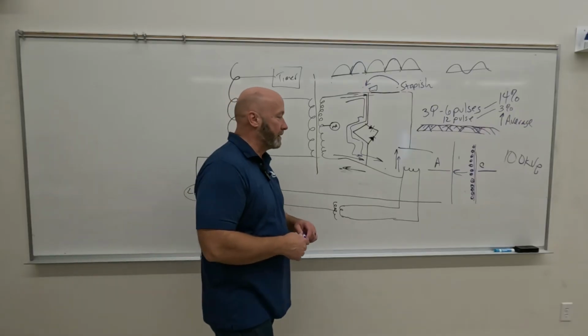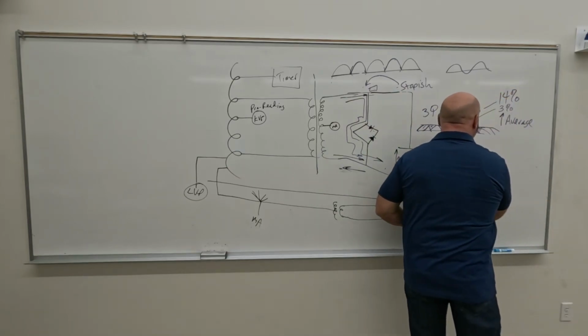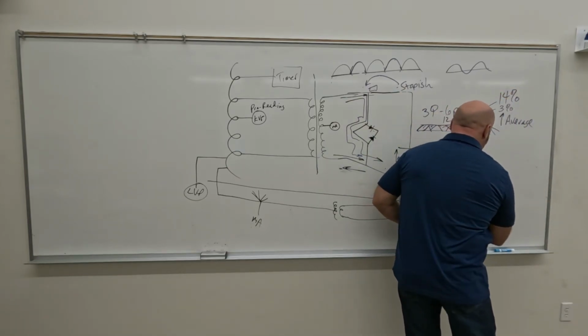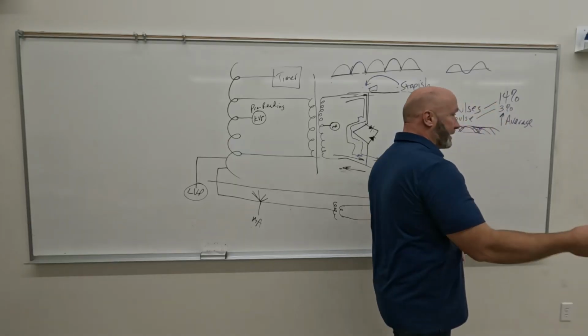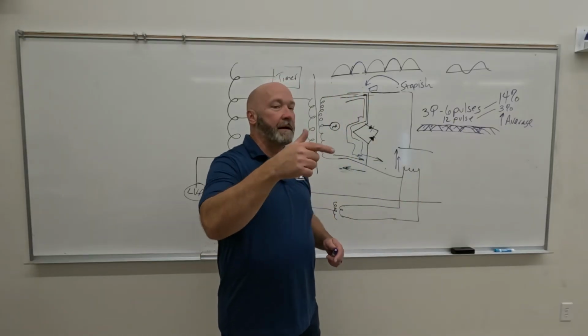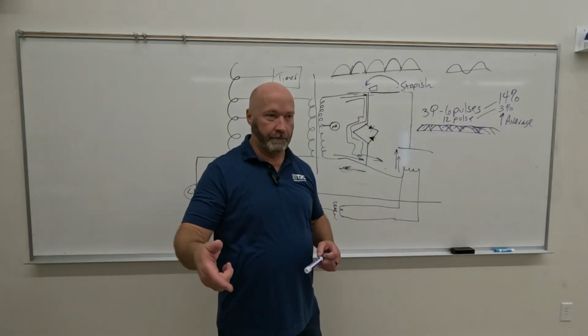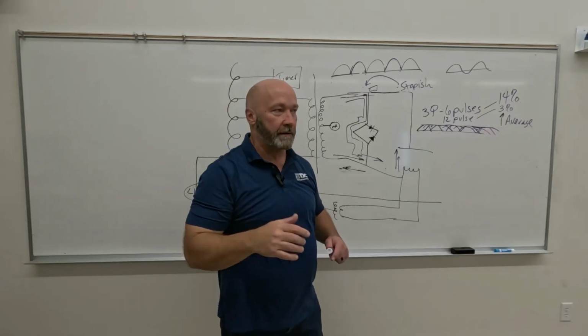And how they work is, if you remember back to the falling load generator, I'm bringing that back up because you might have a tendency to confuse the two. Falling load generator, the MA drops throughout the exposure, right? The MA starts very high and it drops throughout the exposure.